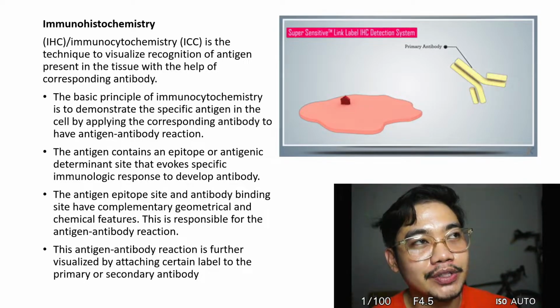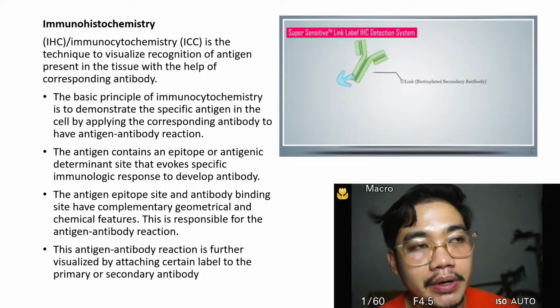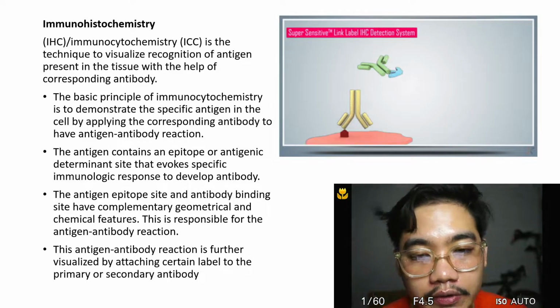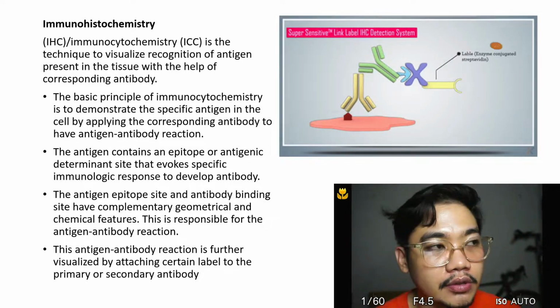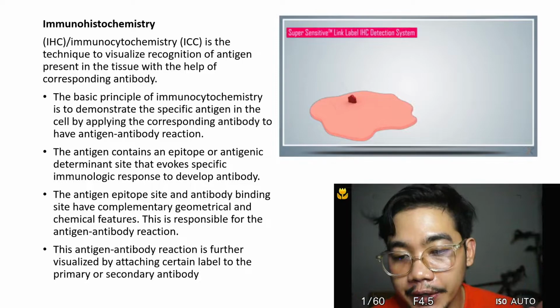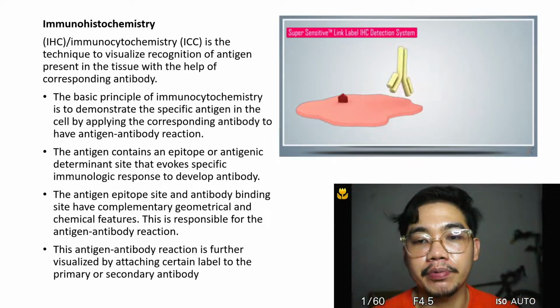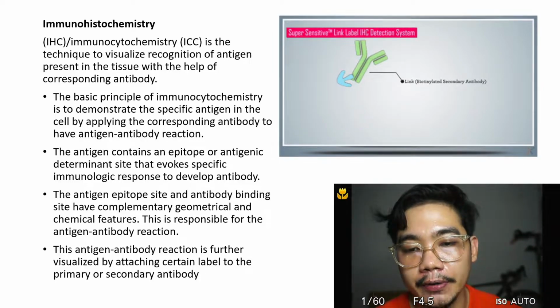And you would still have to make the FAB site of your primary antibody tailor-made, then it's quite tedious and it's not cost effective. So what you'll make is a primary antibody that is specific for that type of tissue, and then you'll just make a generic secondary antibody that attaches to the FC portion of any antibody, non-specific binding, no.